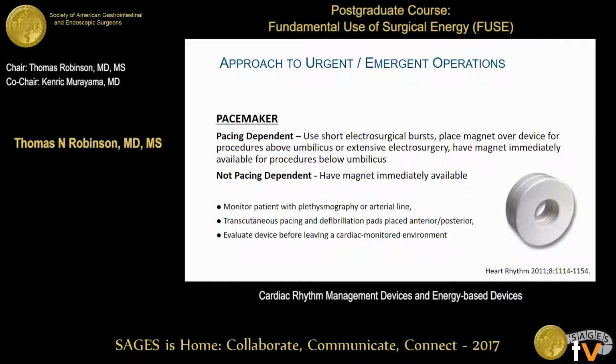So if the patient is not pacing dependent, in other words, the native heart rate is working, the native electrical system of the heart is working, you should always have a magnet available. You should always be putting on your external pacing pads, but you can just perform the operation. So you just proceed with your operation.